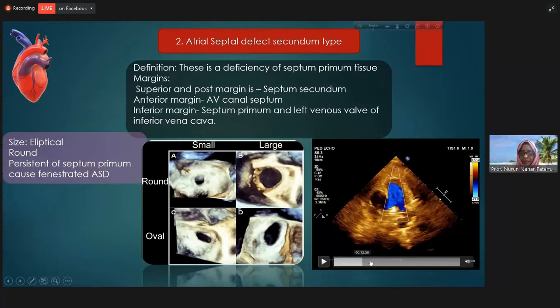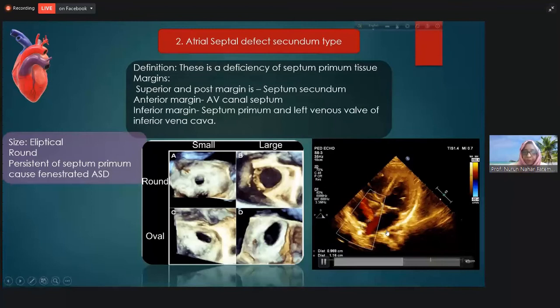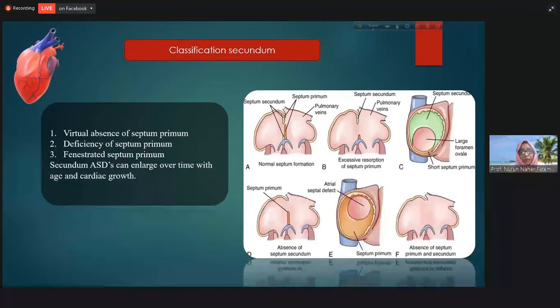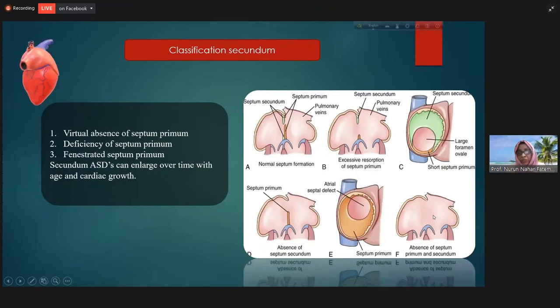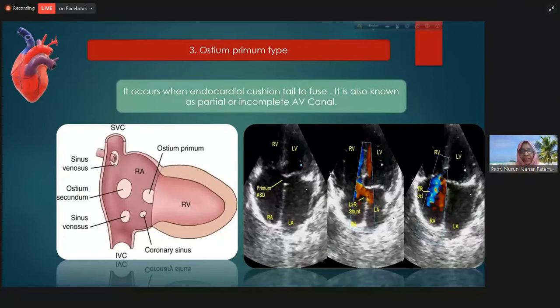Here in the video we are seeing the pulmonary artery and the atrial septal defect with left-to-right shunt from the left atrium, which is evident by the presence of the pulmonary veins. The classification of the secundum type includes complete absence — a common atrium — circular, elliptical, or oval shapes, and a fenestrated type with multiple ASDs if there is only fenestration in the septum primum.